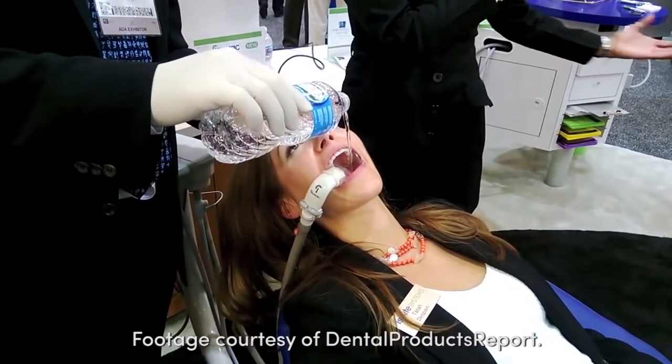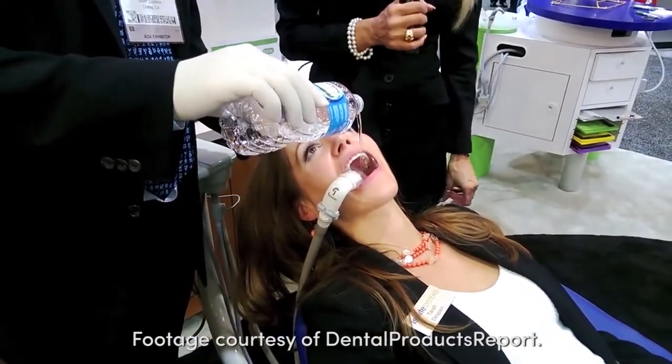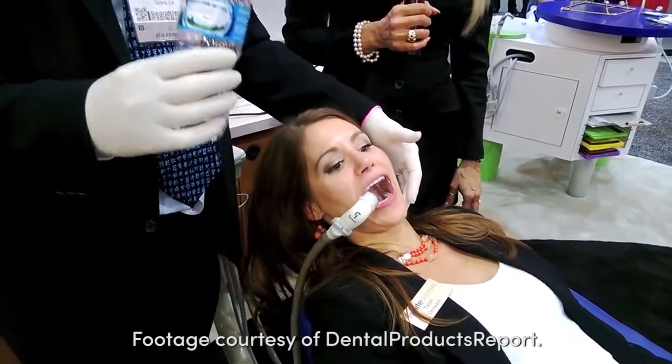Total isolation, total control of the oral environment — and as you can see, nothing goes down her throat whatsoever.